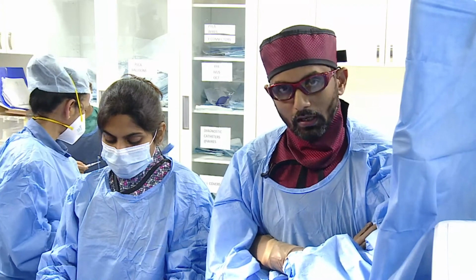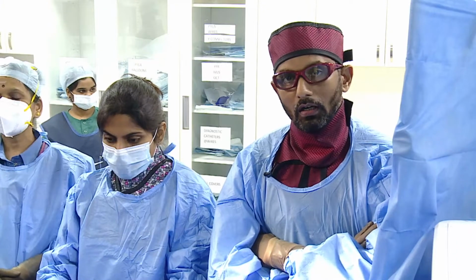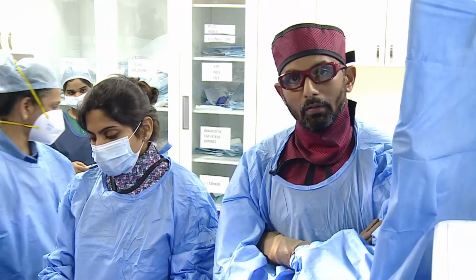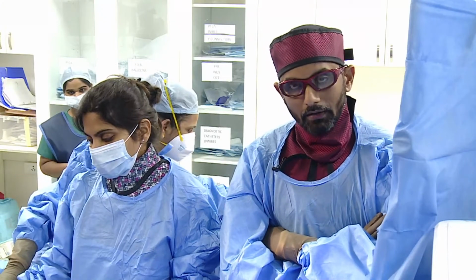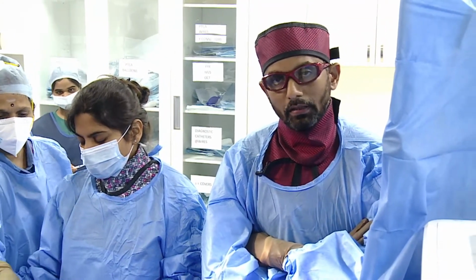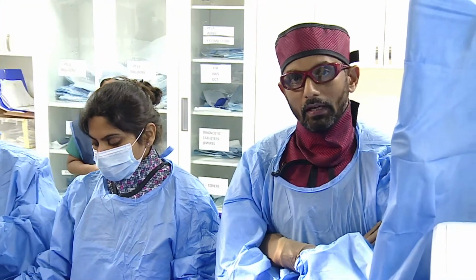So recently he got admitted in his local hospital in acute ST elevation MI and he was thrombolyzed for the anterior segment ST elevation MI. Then they did an angiogram in the local hospital which showed that the LIMA to LAD was completely occluded. There is a vein graft to the distal PDA of the right coronary artery that was also occluded. But the RIMA graft to the obtuse marginal was functioning well. The native left mainstem looks okay.